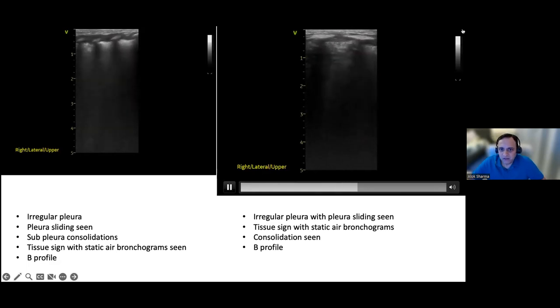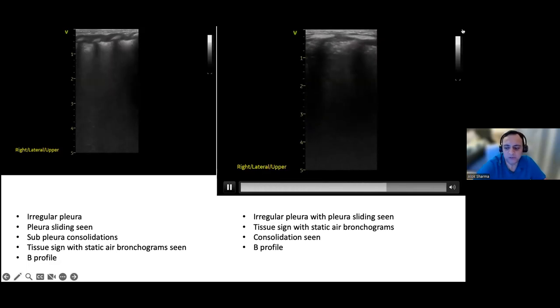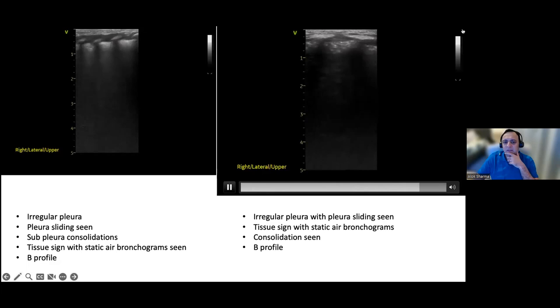And when the probe moves with the sliding, you probably get an element of lung that's coming in there. So it just needs a little bit of movement of the probe, a little bit more gel if that's less. Sometimes what happens is you've got good gel in the top half and you slide down. Did you slide down? Or did you take the probe off and place it down? Took the probe off. Okay, that should be fairly okay then. I think that's artifact. If it was on the left, I'd be thinking, is that the heart coming in? But it's on the right. Yeah. So, but I think that's artifact.